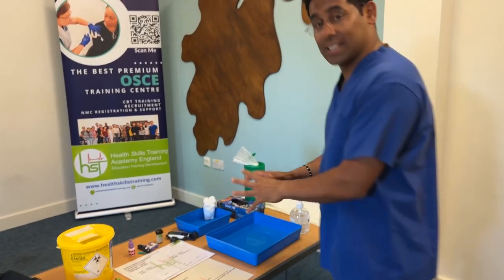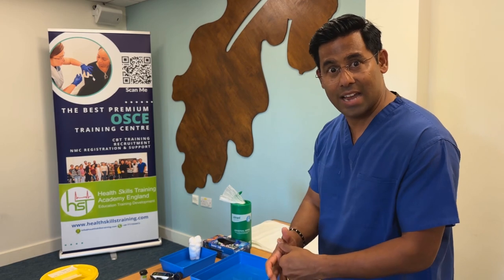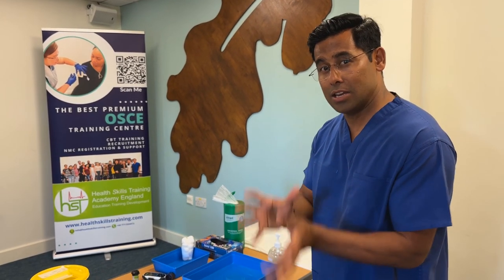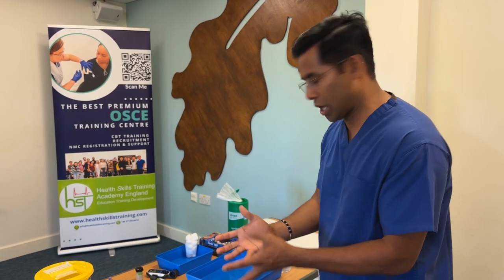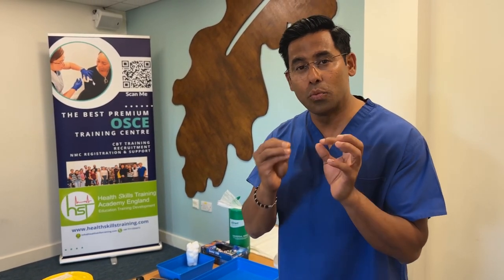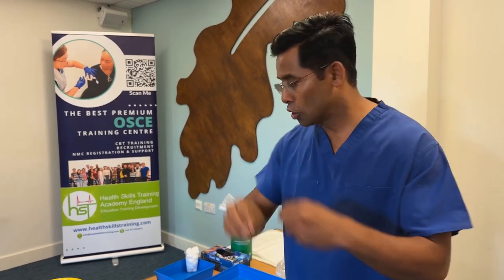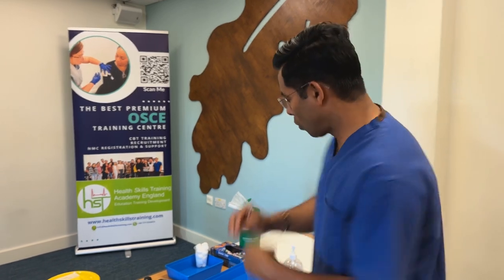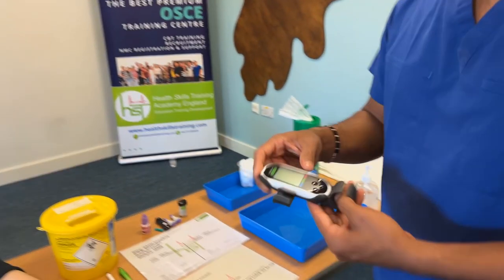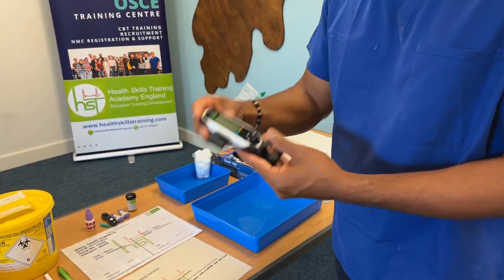Once the tray is clean and ready to use, go straight to gather the items. The heading 'blood glucose monitoring' tells you that you need the monitor. You get different types of blood glucose monitors, but the functions are pretty much similar.